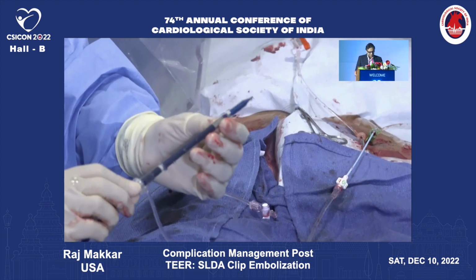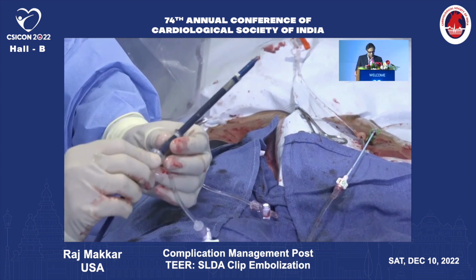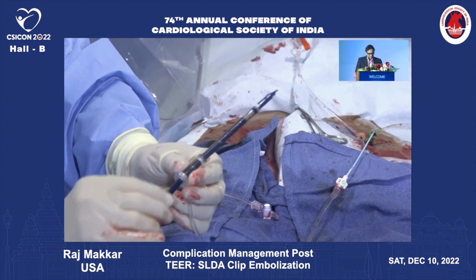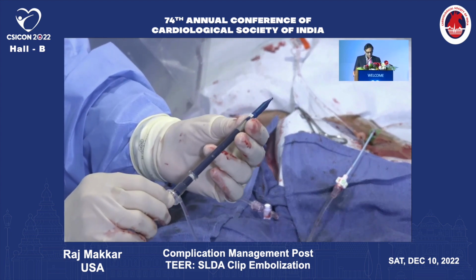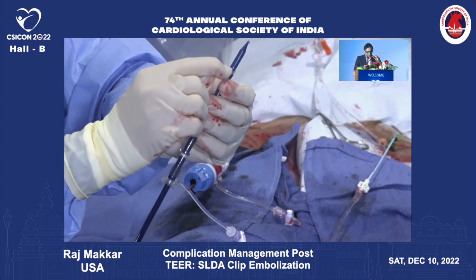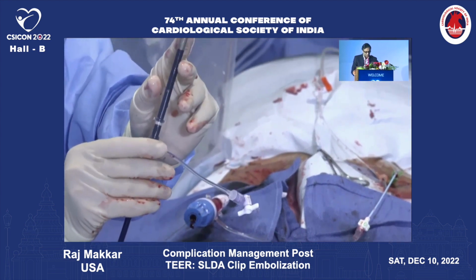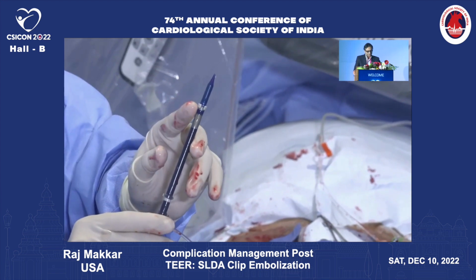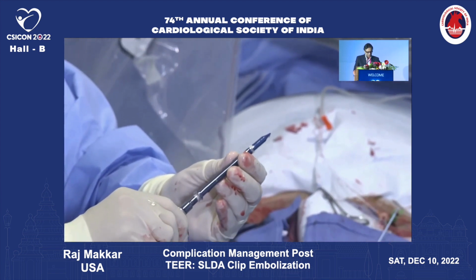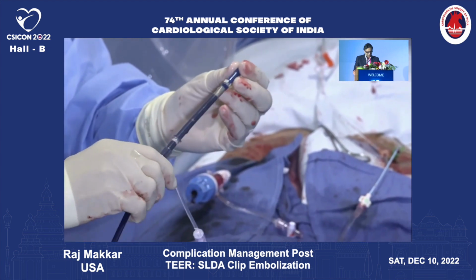So the valve is here, and this is the introducer tube, which is on top of this delivery catheter. The valve is contained there. I don't know if you can see, these are the 3 locators, and we have to be careful as we are introducing it to make sure that they are introduced properly.